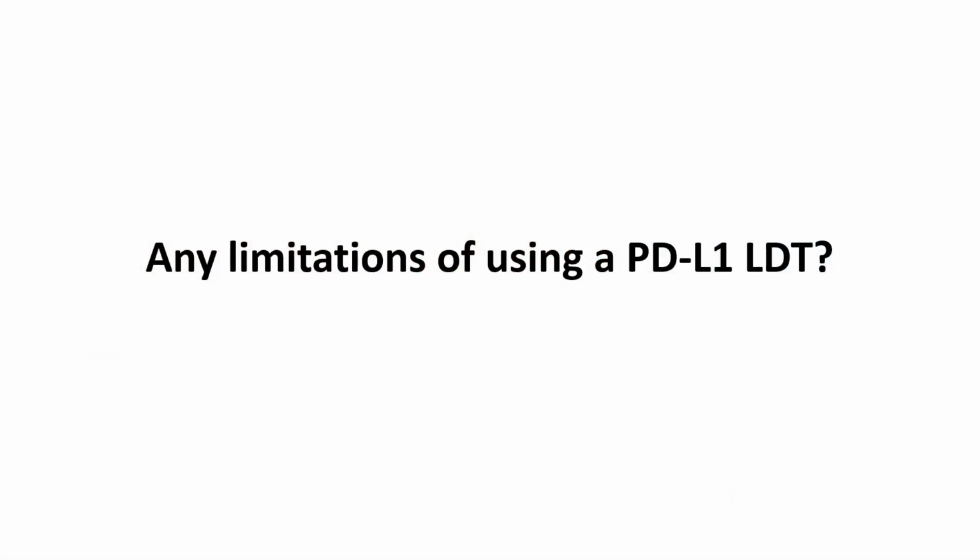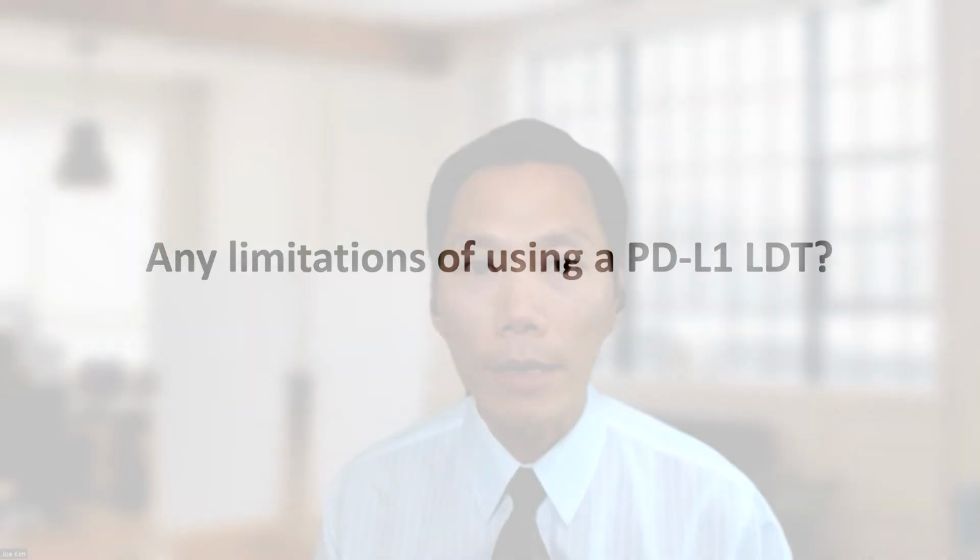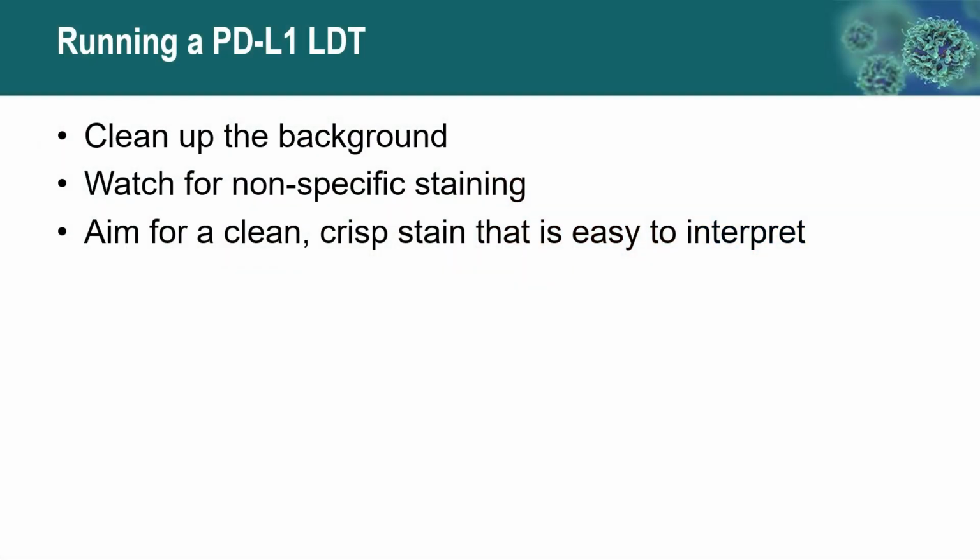So in your experience, have there been any particular limitations of using an LDT as opposed to essentially running the companion diagnostics when it comes to PD-L1 testing? Everything we do is a laboratory developed test with PD-L1. And the struggles that we've encountered mostly pertain to cleaning up the background, making sure you're getting rid of nonspecific staining, just making sure that you have a clean, crisp stain that is easy to interpret.